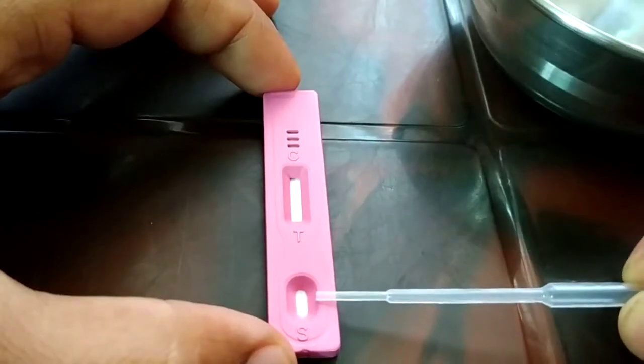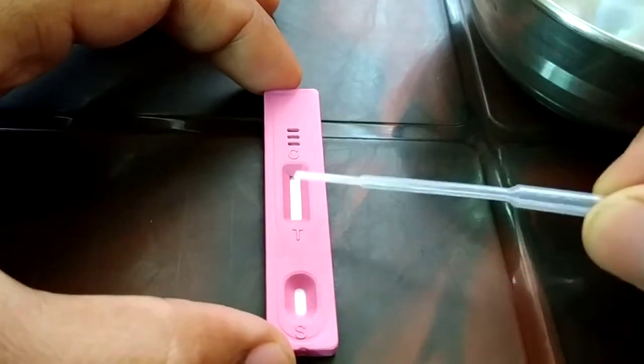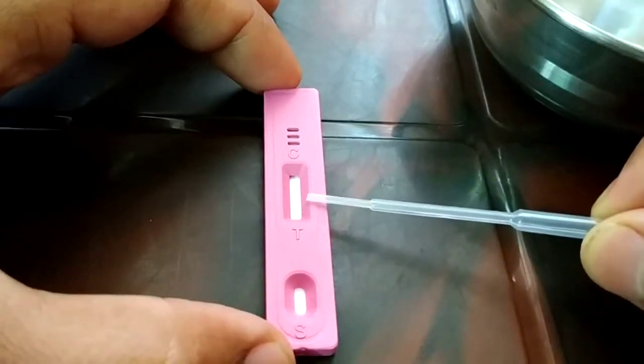You will see two different portions: this is the place where you will be dropping your liquid for detection, and this is where you're going to see the result.